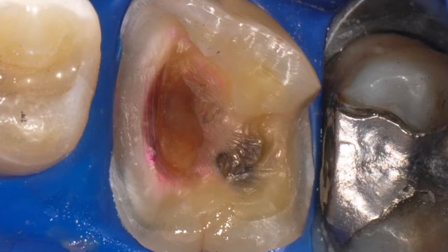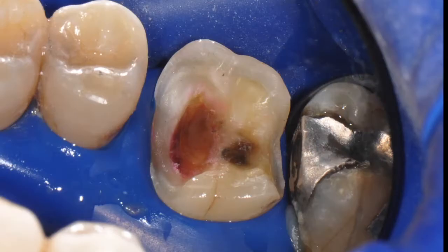In this slide, you can see the deep caries dyed light pink, but the dentin around the deep decay is not stained, indicating healthy bondable dentin. Following caries removal, the outline prep is completed and smoothed. This tooth required full occlusal coverage and bevels were placed on enamel margins to enhance bonding surface area. Air abrasion was also performed to enhance bondability to the dentin.